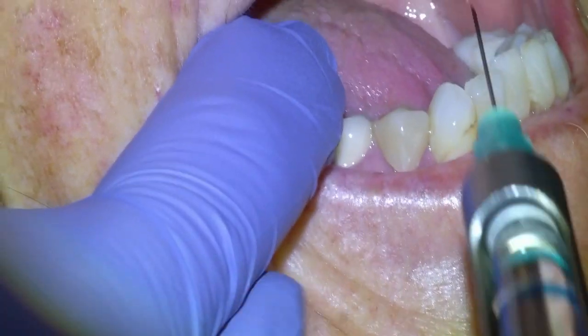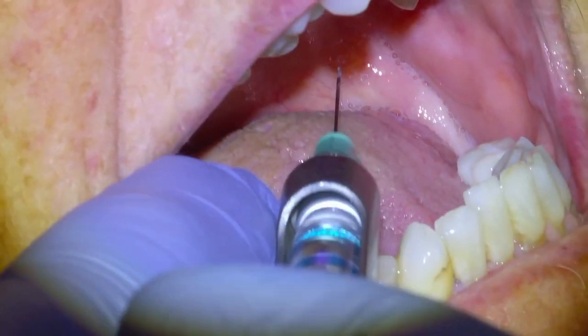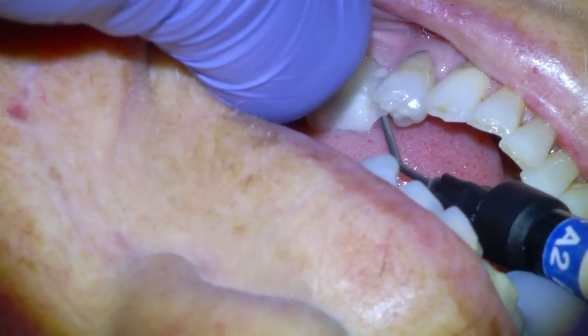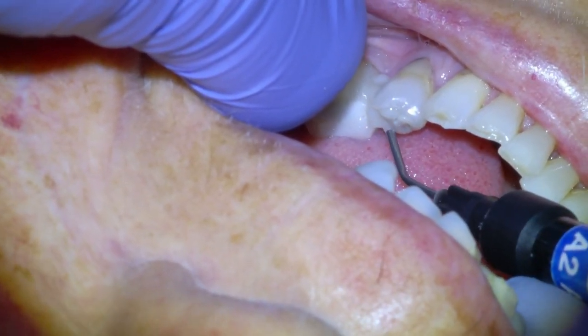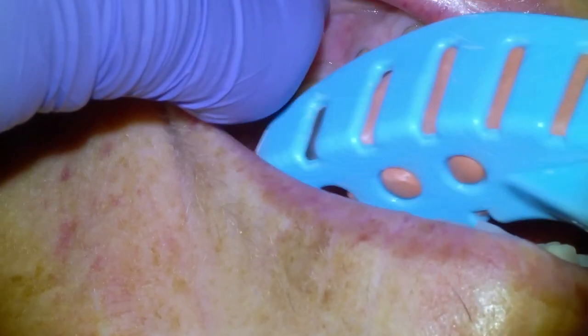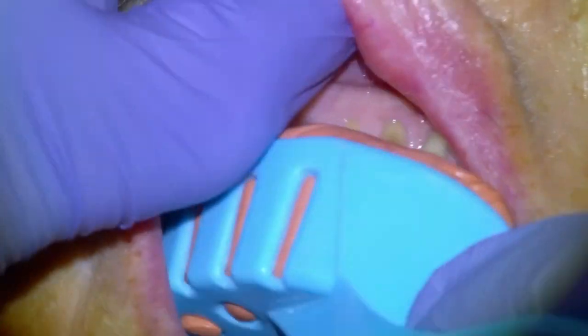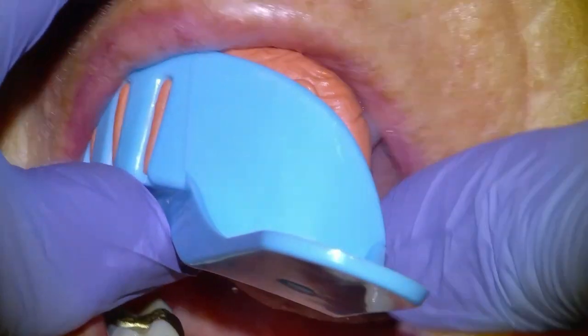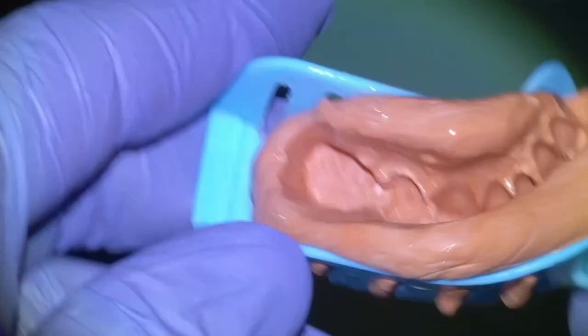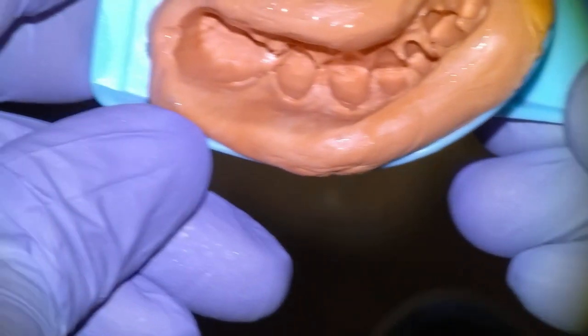Getting on to the procedure and the clinical footage, we're going to begin by administering a mandibular nerve block. Before we get our preliminary impression, I'm going to put a little bit of flowable composite into the missing tooth structure, light cure it, and then get our preliminary impression for making the temp at the end. We'll give that material time to set and we're satisfied with that preliminary.